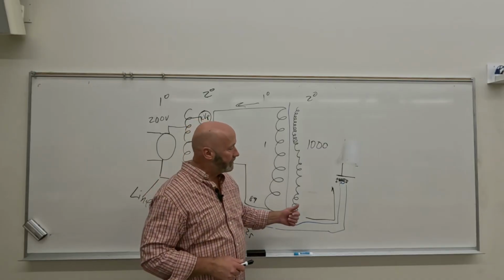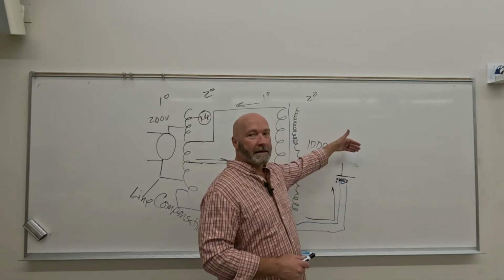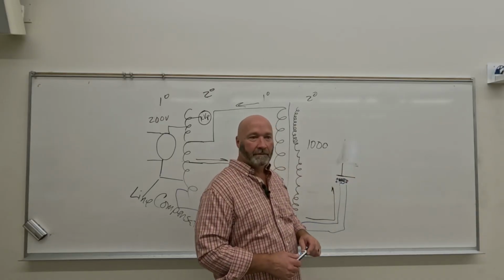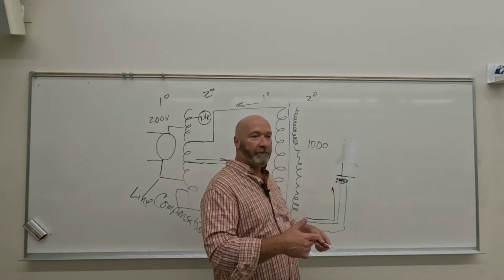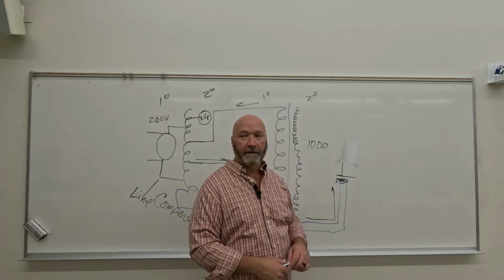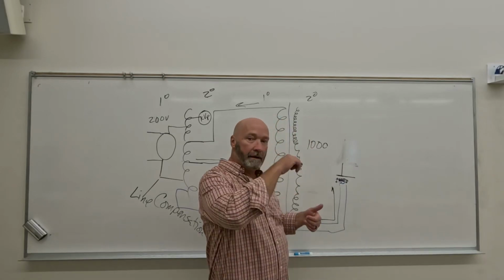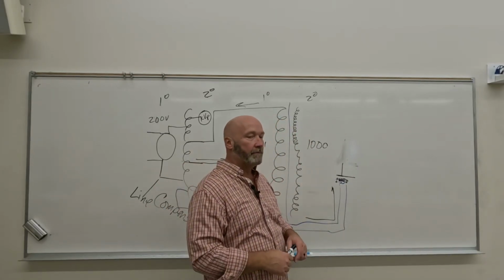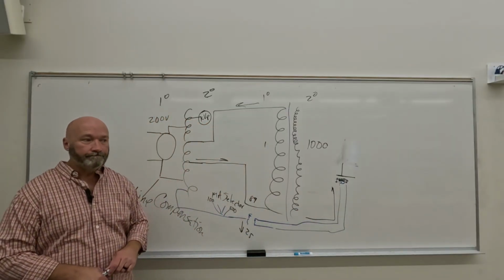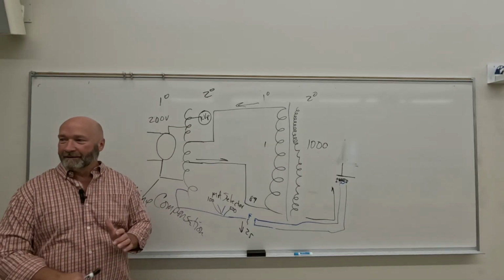But at the very minimum, if we don't send electrons back across the tube, then we're only using half of the wave. And so, is X-ray creation efficient? No. If we're only using half of the wave, how much less efficient is it? Half as efficient. So we're going to talk about how that actually works. We're going to change our voltage waveform from alternating current to pulsating direct current with what we refer to as rectifiers, and it's just semiconductors. That's lecture for not Tuesday, but Wednesday. Yeah. All right. Any questions?